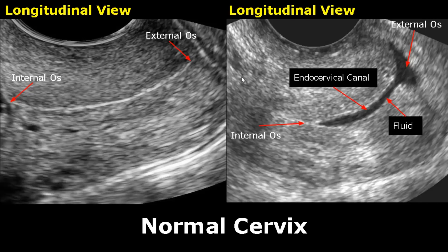These are transvaginal images of the cervix in longitudinal view. The internal os is the junction between the body of the uterus and the cervix. It is the upper part of the cervix and will be seen on the left side in the image. The external os is the junction between the cervix and the vagina, and will be seen on the right side. The area between the internal os and the external os is the endocervical canal.